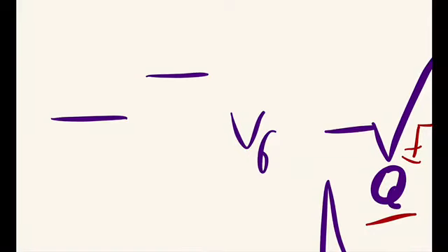Why is there lowering of this PR interval? The basic concept is that the baseline in this PR interval is showing us the repolarized state of the ventricles.